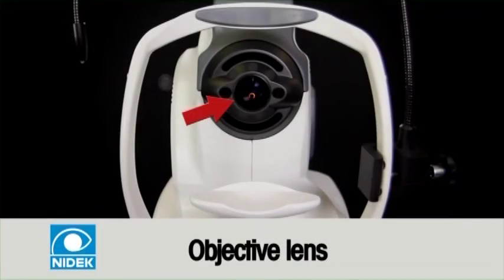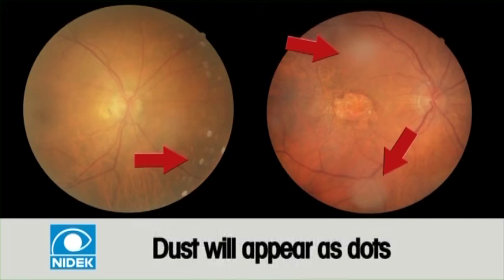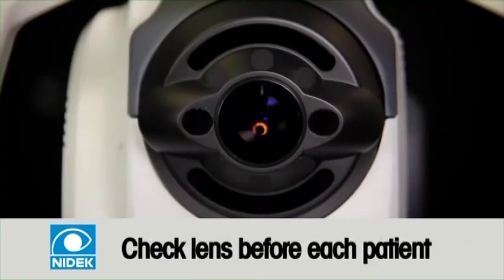The objective lens is where the patient looks into while the image is being captured. After time, debris collects on the lens and must be cleaned properly. If left on a lens, artifacts will appear on all images. Dust will appear as little dots out in the periphery. Smudges appear as white or gray smears on the images. The lens should be checked before every patient and cleaned as needed.